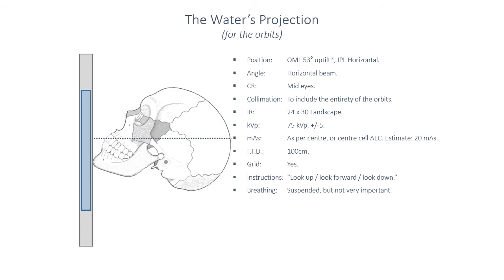You are going to tell the patient to look upwards and to fix their gaze on a particular point and to keep their eyes very still, and you'll perform 1 projection like that. The second projection with their eyes looking straight ahead. The third projection with the eyes downcast. A downward gaze, once again, fixed on a point in space.